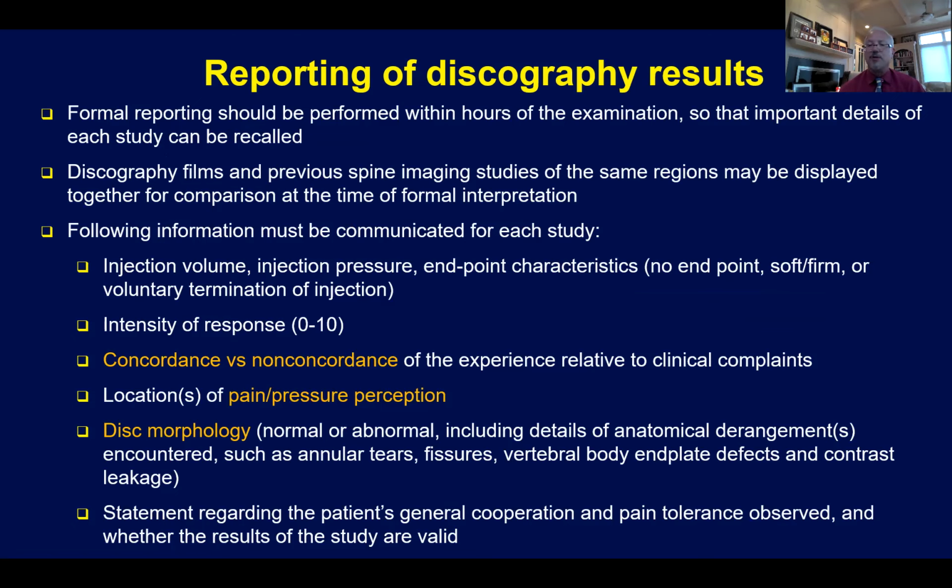What was the pressure, the starting pressure, the opening pressure when we first saw contrast filling the nucleus pulposus, and the final actual pressure upon termination? These are endpoint characteristics. Was there a pain report? Was it concordant, meaning the patient's usual and customary pain? Was it dissimilar? What was the pain level? What was the starting pain level and the final pain level? Does it reach at least a 7 out of 10 on a numeric rating scale?